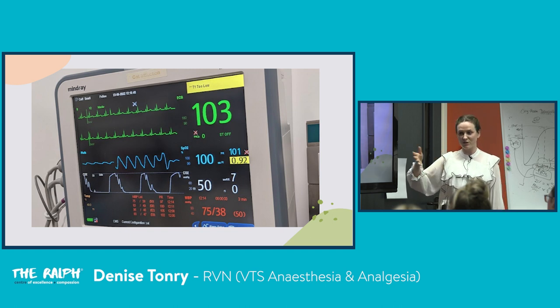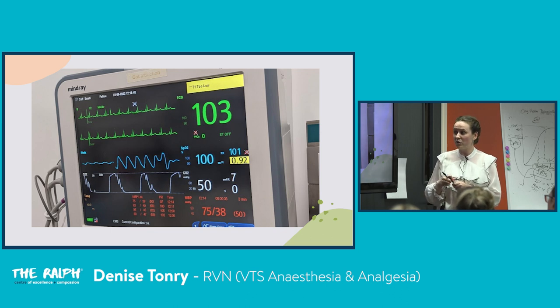T-pieces they tend to cope well with, as we all know, but we're leaning a little bit more towards using circles with smaller tubes. They're low resistance, so they should be able to move the valves. But if you have a sticky valve and a small cat, this may not be the case. You can do many things. You can change them to a T-piece. You can wait. Maybe you've just induced them and they need 15, 20 minutes to come off the induction agent and they'll start to increase their respiratory rate. Or you can ventilate them.